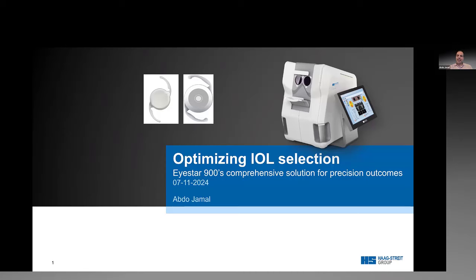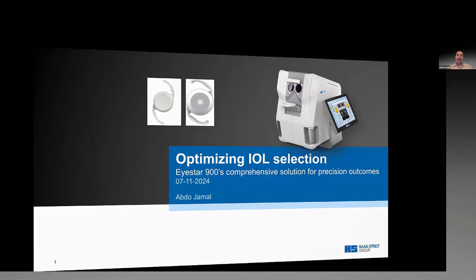Our topic today, as Sam mentioned, is how to utilize Eyestar comprehensive measurements to optimize IOL selection. Our objective is to show how Eyestar supports us in making safer and better decisions.